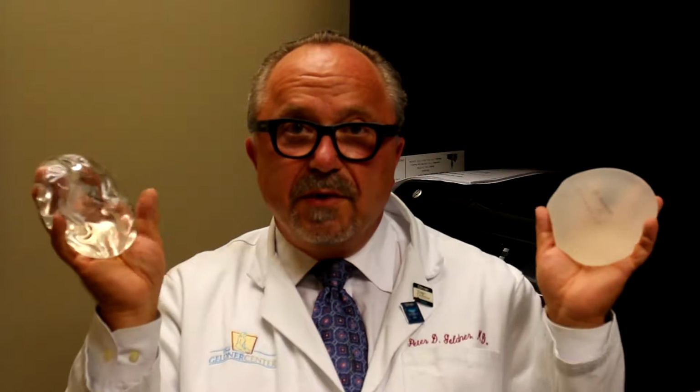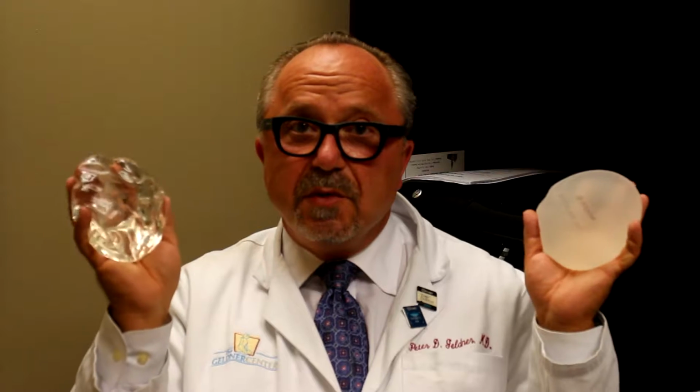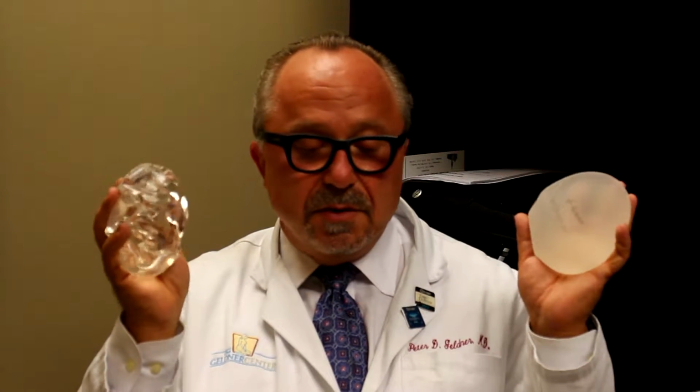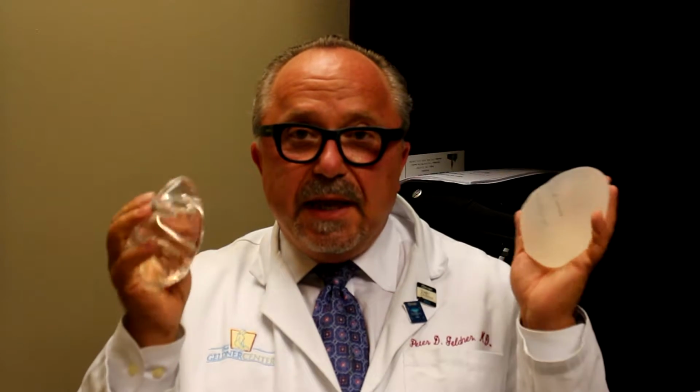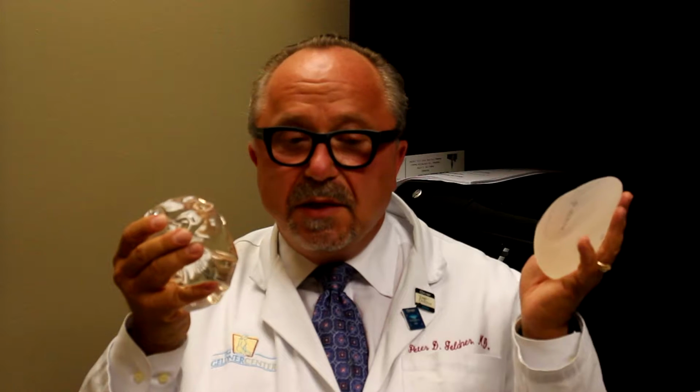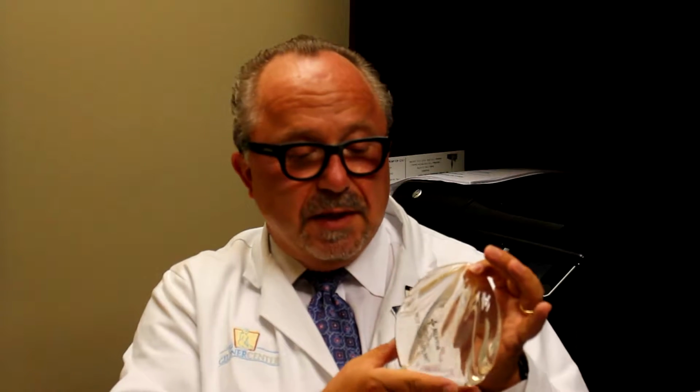Neither of these were ever in anybody. These were designed to show what they look like, but these are exactly the same thing as the implants that I use. If somebody has an attractive breast with a nice shape and everything is basically great, and all we're going to do is add volume, then probably the best thing to do is to use a smooth, round implant, placing it underneath the muscle so that we have a little bit of fullness that's brought in.